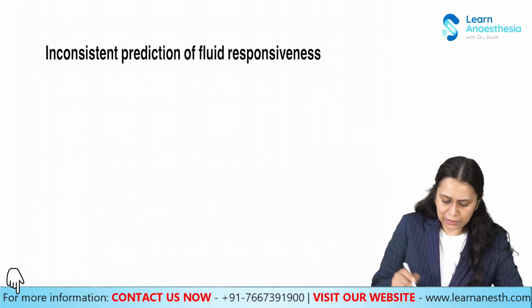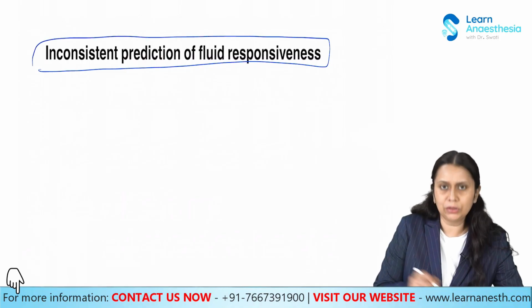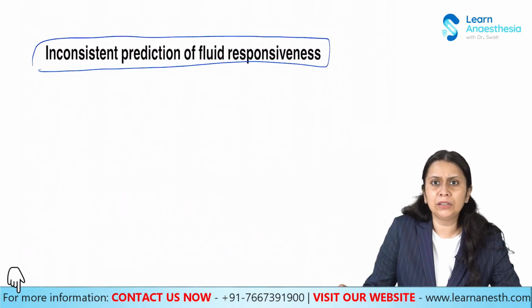Well, it is inconsistent in prediction of fluid responsiveness. Both your CVP and pulmonary artery catheter have shown this inconsistency, especially CVP, which is very much affected by the heart condition and also by the intrathoracic pressure.